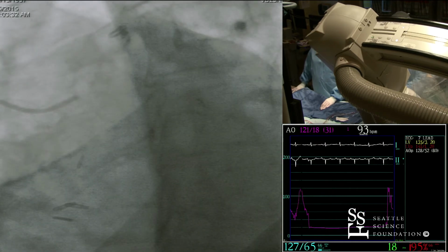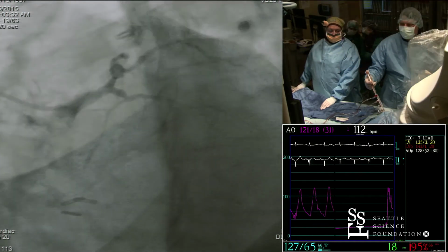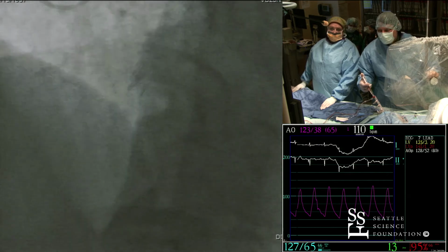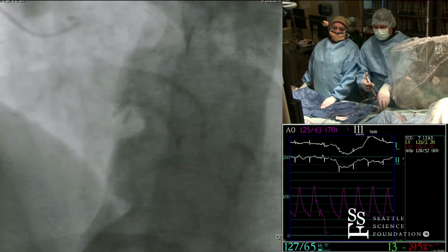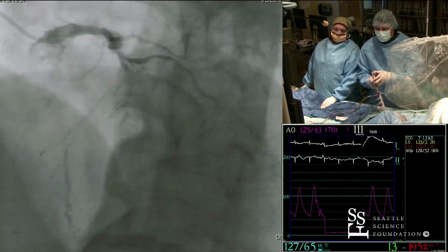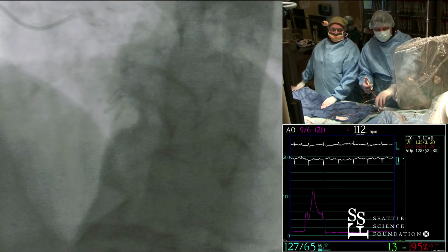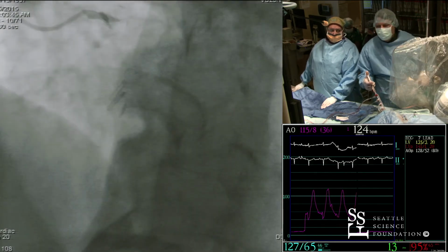Okay, caudal. So again, once he has access, it's exactly what Mauricio said earlier. It's just a standard angiography case. And the same holds if we're going to rotablate or whatever we're going to do. It's going to be pretty much the same.